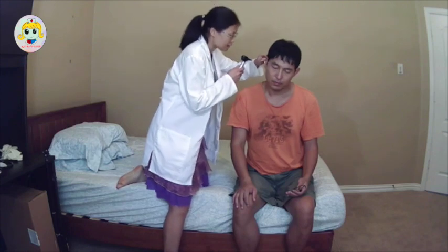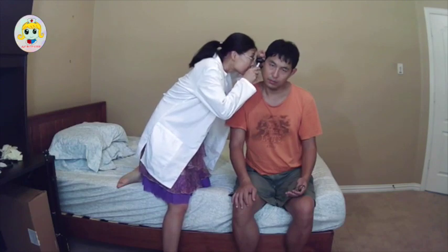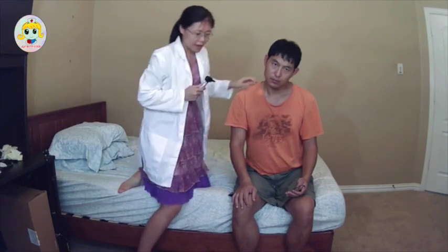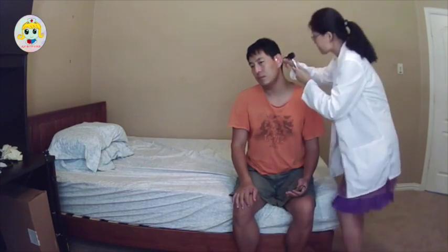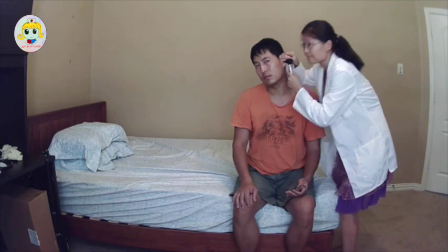Then I will look inside your ear using my otoscope. I will pull the pinna up and back. Okay, I will look at the other side. Pull your pinna up and back. For both sides, the ear canal is clear. There is no swelling, no occlusion, no drainage, no erythema.